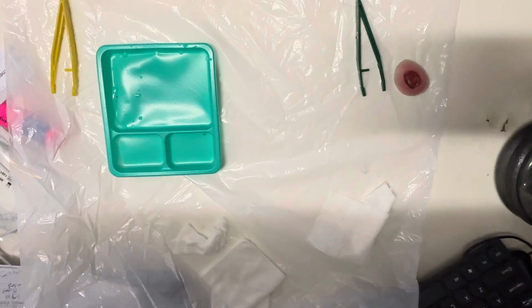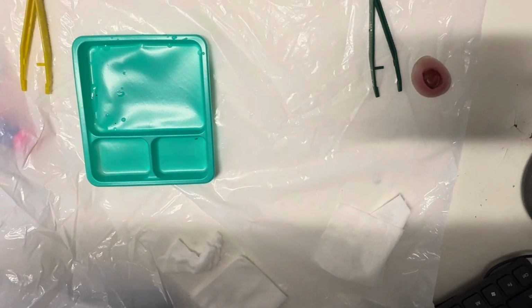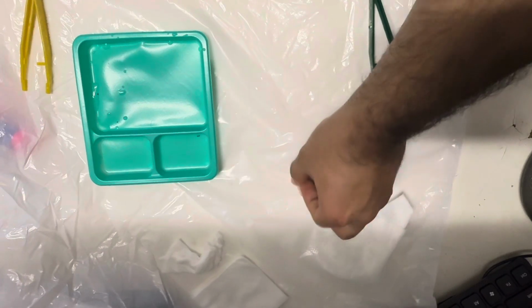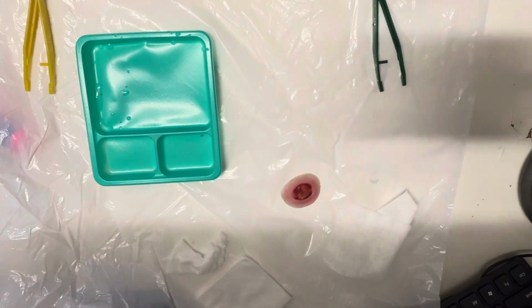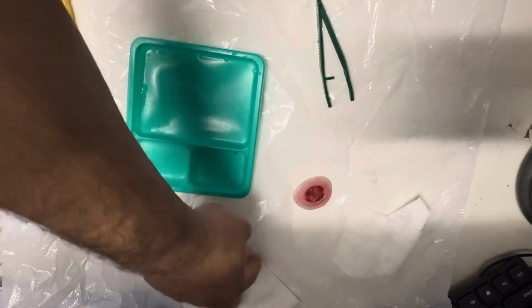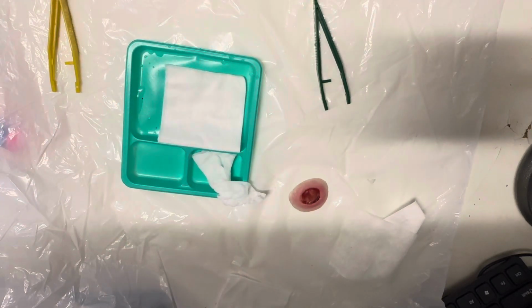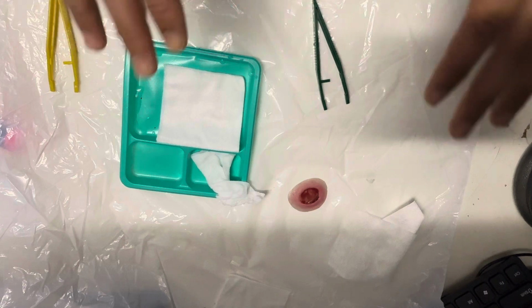So today I'm going to explain how to do the wound assessment and your wound swab. Let's do the wound assessment first, and this is our wound, for example. Let's just understand that this is on the patient's body, and this is my kit, the wound pack that I have already opened, with all the cottons. I've already put saline in here, right? I'm going to explain how to do this wound assessment before getting into the room.